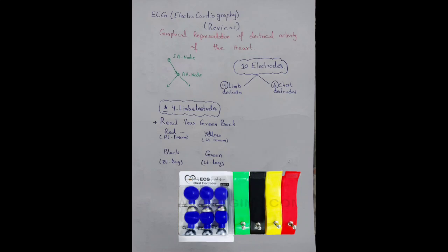So today our topic is about ECG, which is electrocardiography. I am discussing here only the review. I am not going into detail. What is ECG? This is a graphical representation of the electrical activity of the heart.